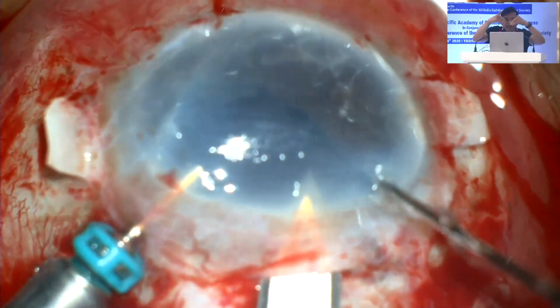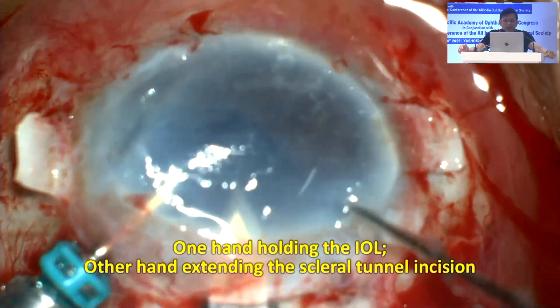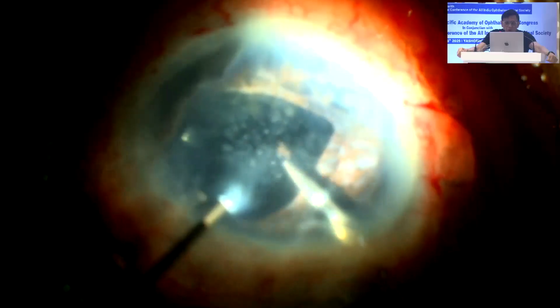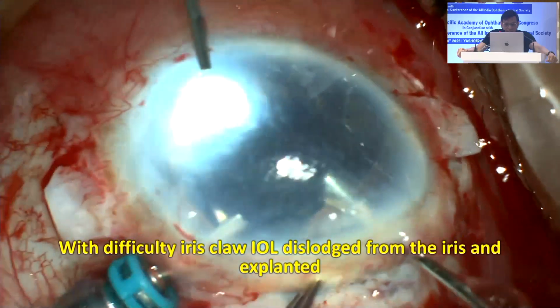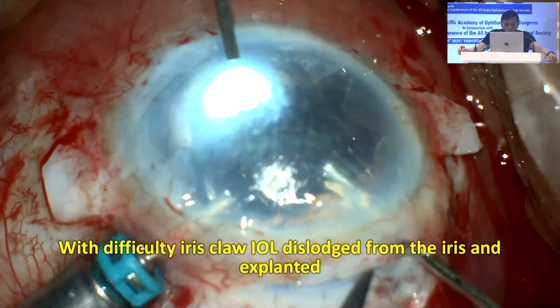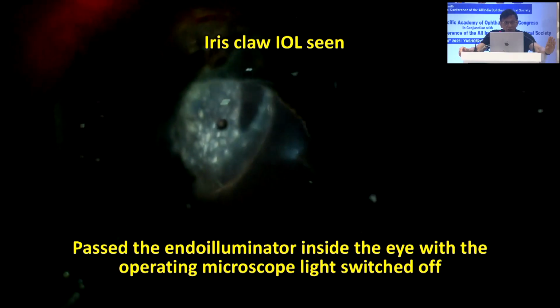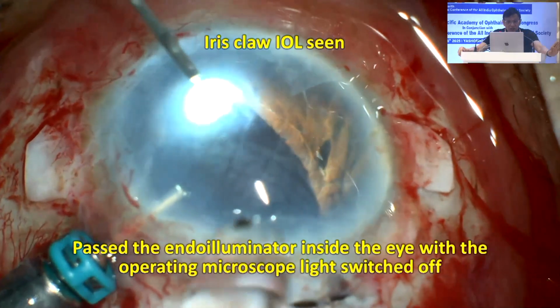I have to make a scleral tunnel. Don't make a clear corneal incision. You are again going to create an extra astigmatism which is of no use to you. So make a scleral tunnel incision. Now catch that iris claw lens, and gradually bring it out. Remember, I have to dislodge it from the iris on the side where it is still stuck.